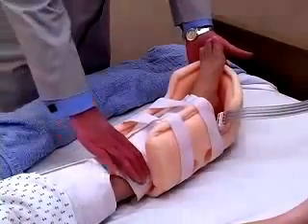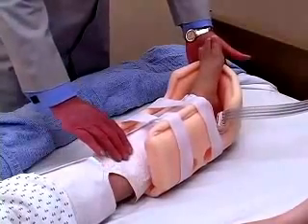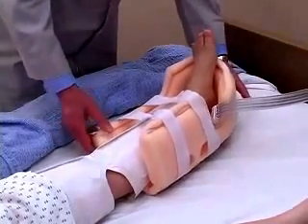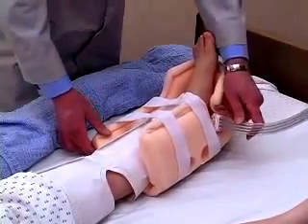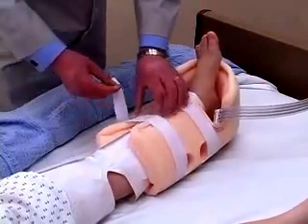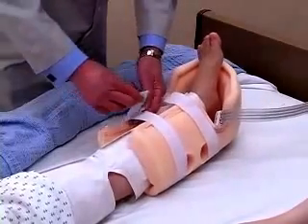If a patient requires the use of sequential compression devices or SCDs to prevent deep vein thrombosis, the design of the boot allows easy exit for the power tubing. The boot can be applied and the straps adjusted carefully to accommodate inflation-deflation without disturbing the device.